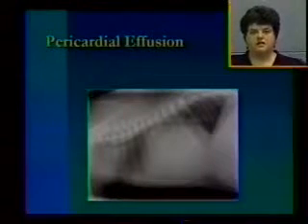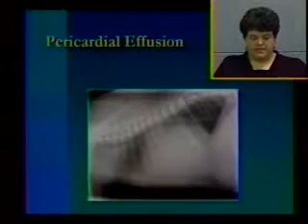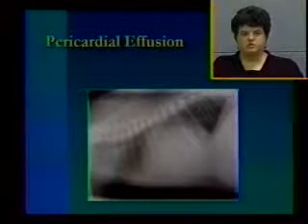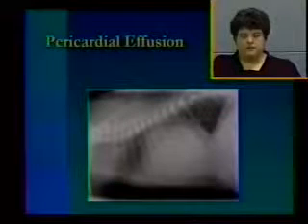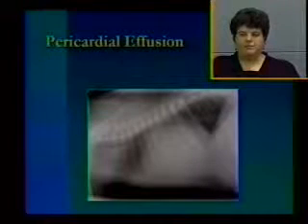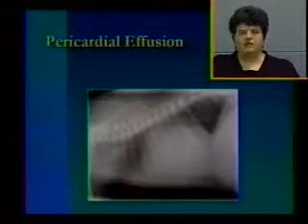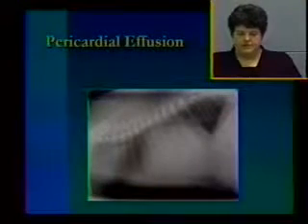Just a pericardial effusion dog, so that you can have a reminder of what it actually looks like. It's the big globoid heart with the rounded margins. Its trachea is parallel with the spine in this case. It takes up a large portion of the thorax and silhouettes with the diaphragm. The other disease that can have this appearance is dilated cardiomyopathy, particularly in the Great Danes and other giant breeds. But this is a dog that needs to have an echocardiogram sooner versus later, because pericardial effusion is a potentially life-threatening disease.